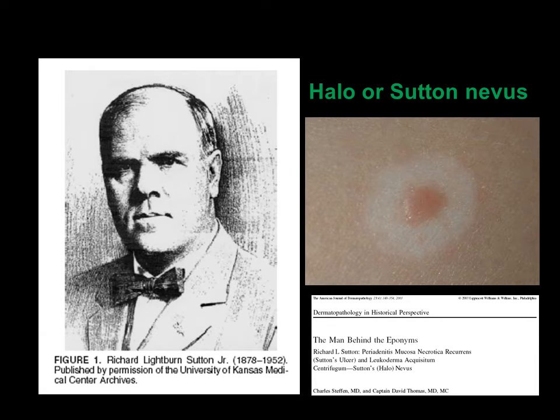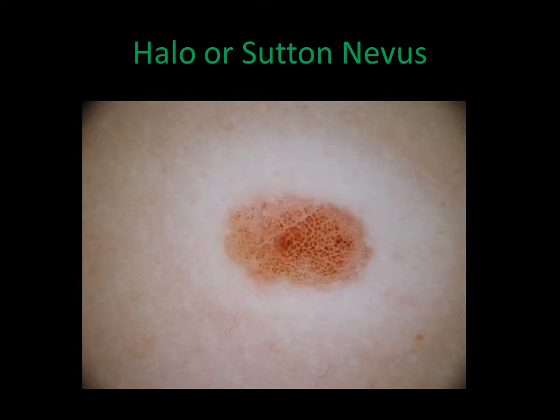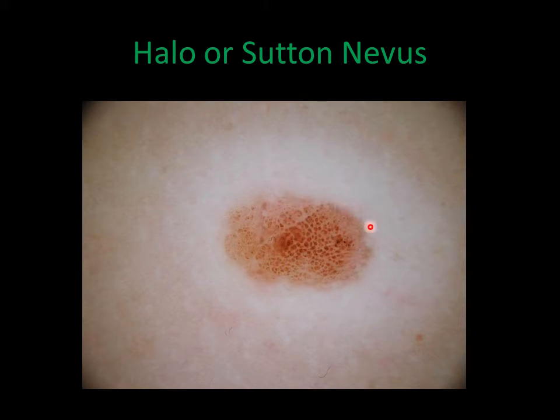This special kind of nevus, characterized by a white halo surrounding the lesion, was first described by Richard Sutton. Here we see the dermoscopic image of a beautiful example. As you can see, the nevus is surrounded by a white halo, and in the center there is the nevus showing a typical globular pattern.